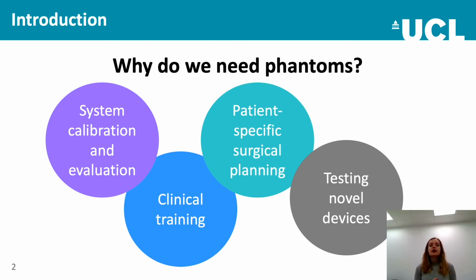So in my work, I've tried to overcome some of these challenges and create phantoms that are anatomically realistic because they're based on real patient data, and they are compatible across multiple imaging modalities, and also they are relatively affordable and simple to fabricate.